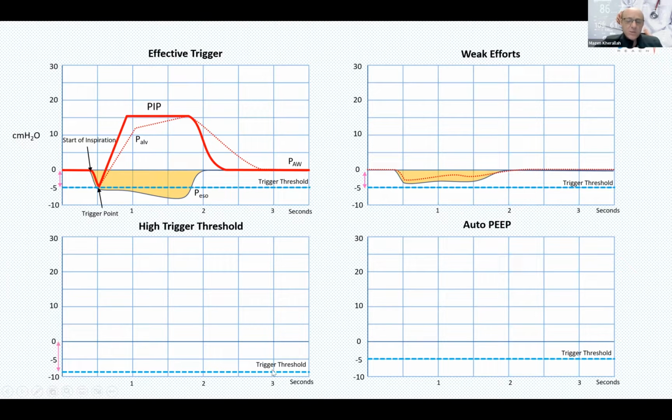We'll see examples for this now. And the breath is ended by the patient. Similarly, if you set the trigger level at a very high level, usually the trigger should be around -3 centimeters. We call it sensitivity also. So if you set it at -1 centimeter of water, that trigger will be very sensitive, meaning that any drop in the pressure will trigger the ventilator.